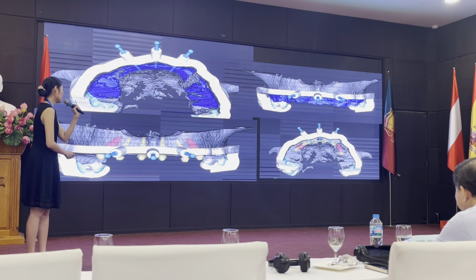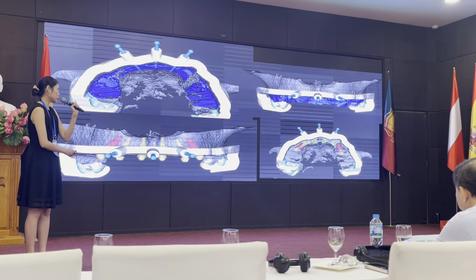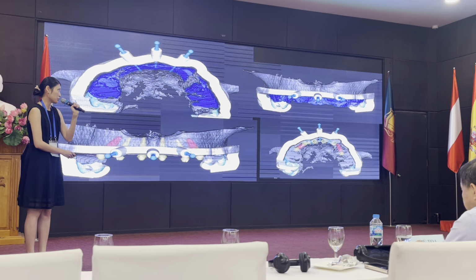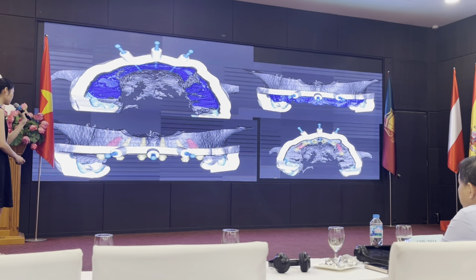And the second thing is you want to have a bone reduction guide. And again, this bone reduction guide is resting on your tooth. So that will give you an idea about how much you want to reduce your bone, and this can be really accurate. And then from there, you can plan your implant position.